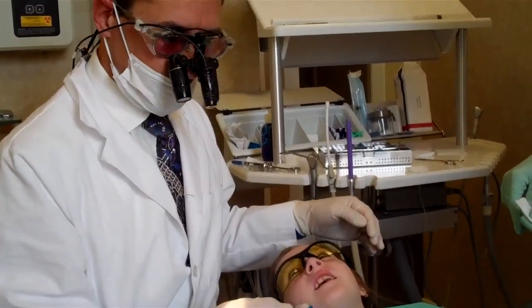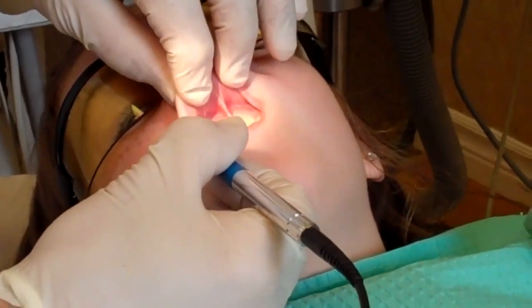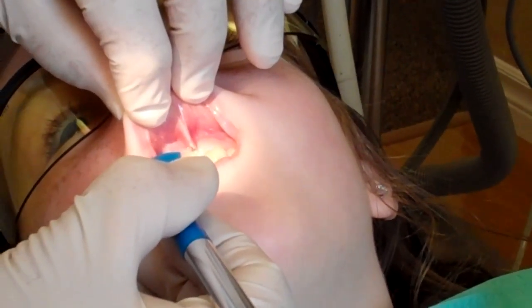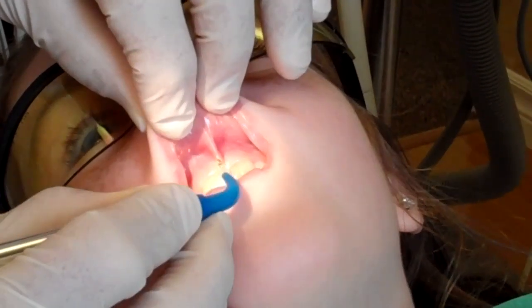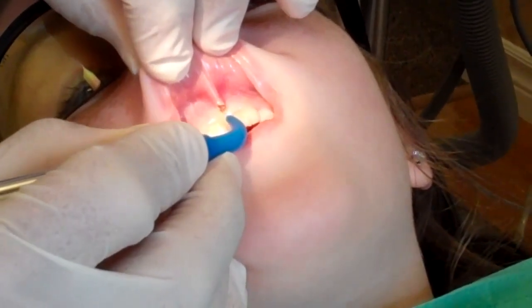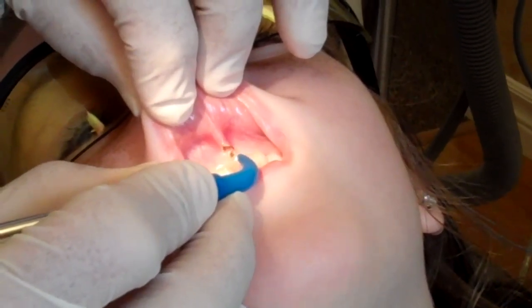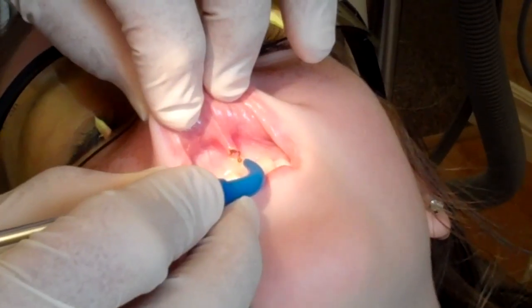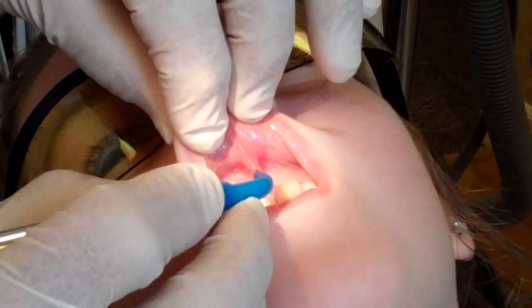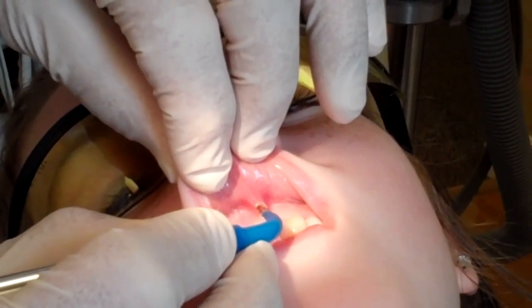All right, so we're going to go ahead and do that now. We have our laser — all we're going to do is pull this up, and as you can see when I turn this on, you can see as we're separating these fibers, just like that. There's no bleeding or anything like that, just kind of coming straight up. It's going to release some of those fibers there — just like that. We're just going to do a little bit more up in here; it just uses light energy to take care of it.